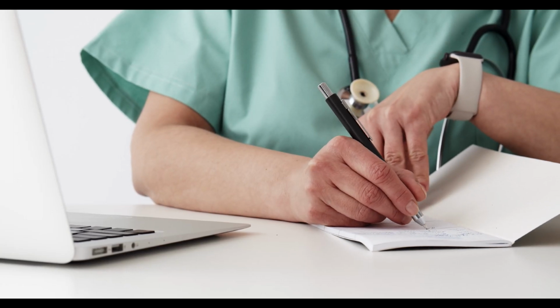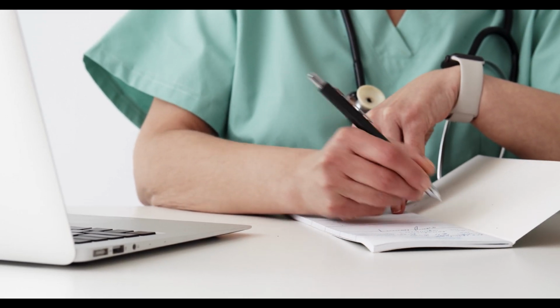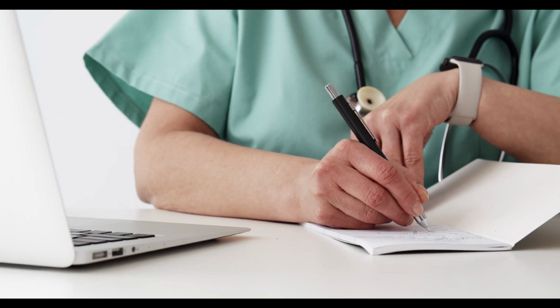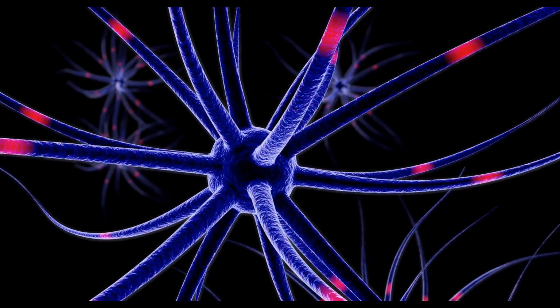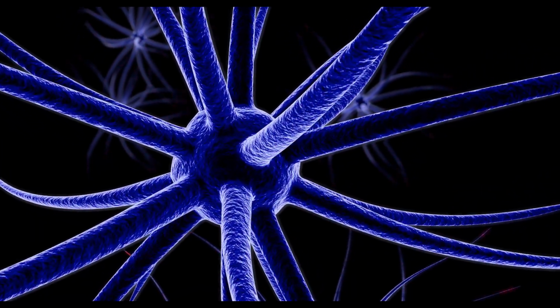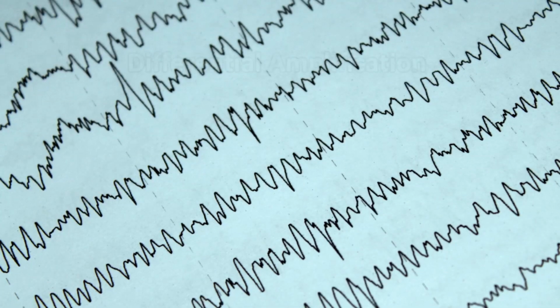So, a healthcare professional will be looking at the health of these communication lines, especially when there may be a neurological mystery involved with the patient. The electrical activity according to this chemical reaction is what the EEG machine reads. It records explicitly the difference in voltage between different electrodes, a process called differential amplification.